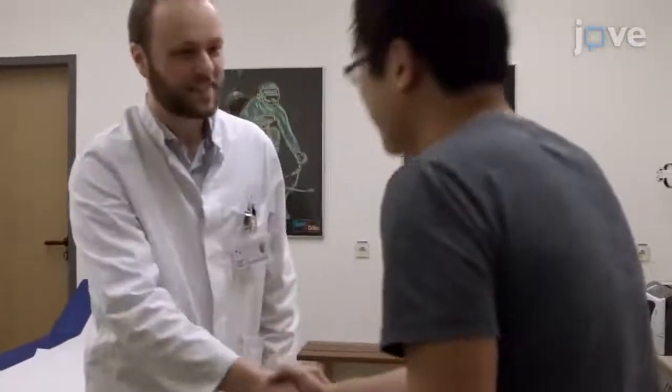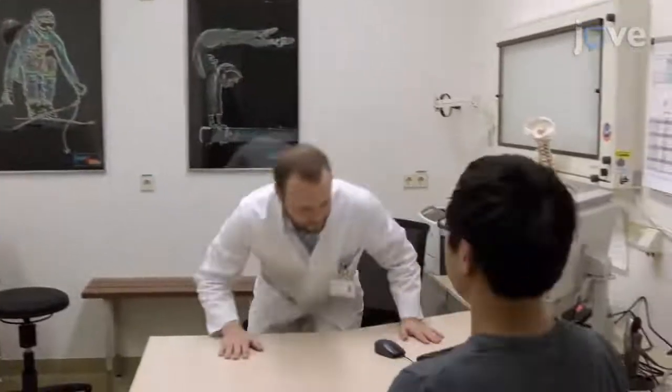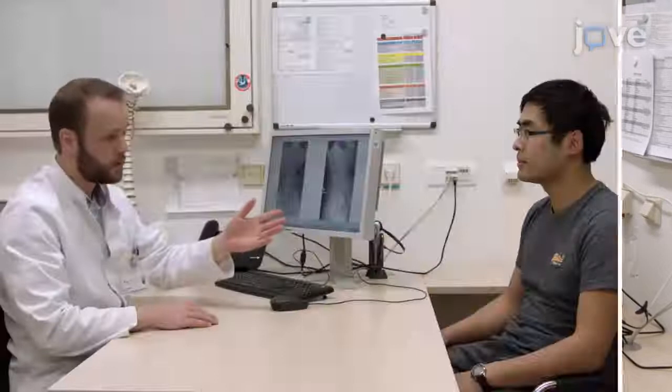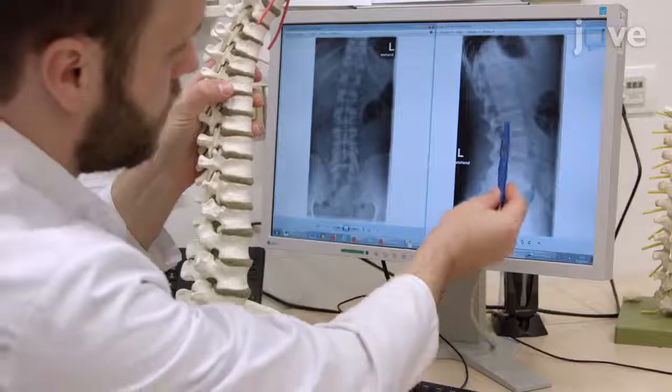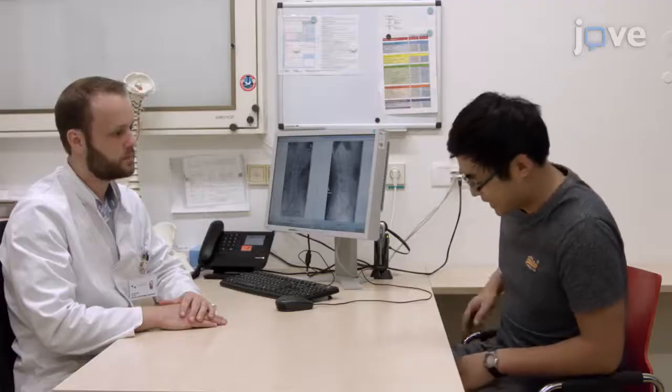Recruit a subject aged more than 18 years who suffers from lumbar back pain and degenerative disc disease. Gather all of the relevant data for the back pain-related patient history, results from X-ray and magnetic resonance imaging, current pain medication, and history of physiotherapy.